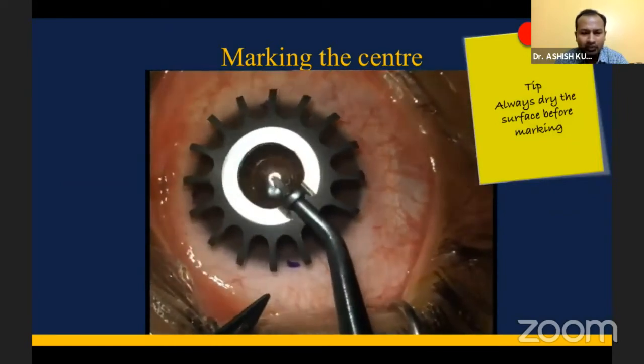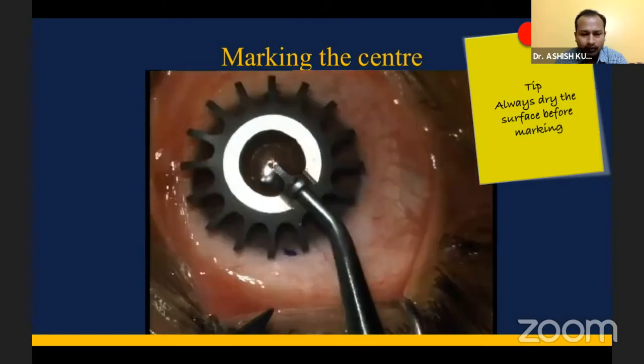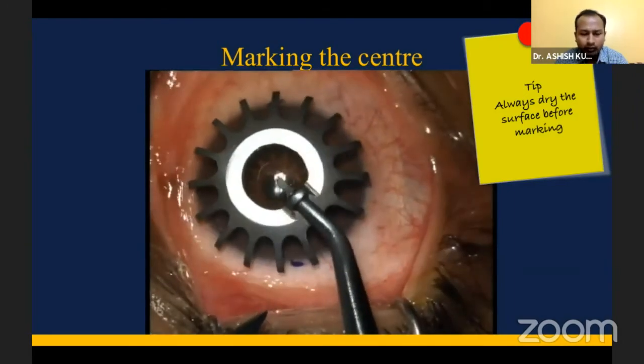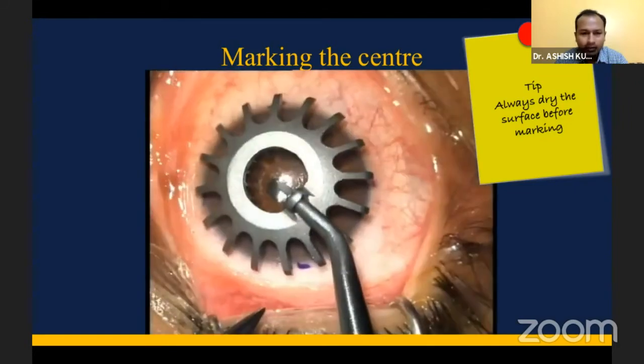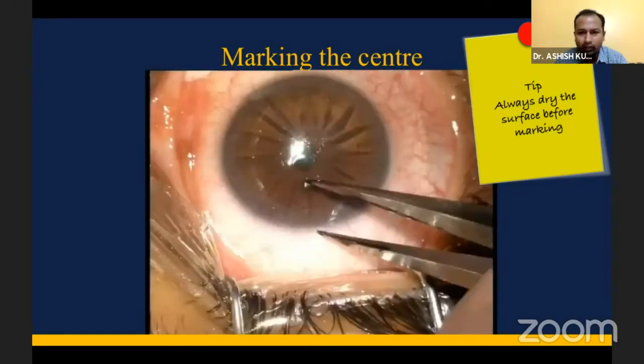And then there's a marker where you actually meet the two, where you mark the center with the pointer here. This is helpful in suture marking.